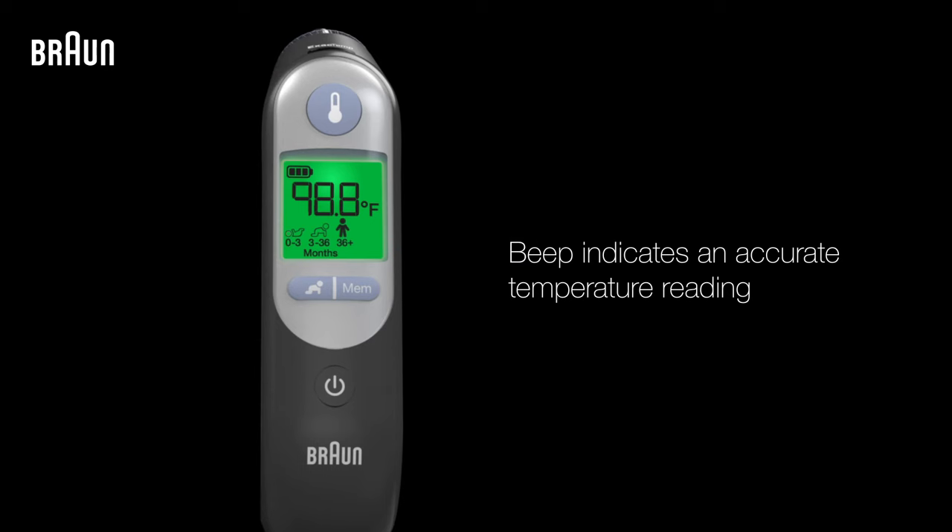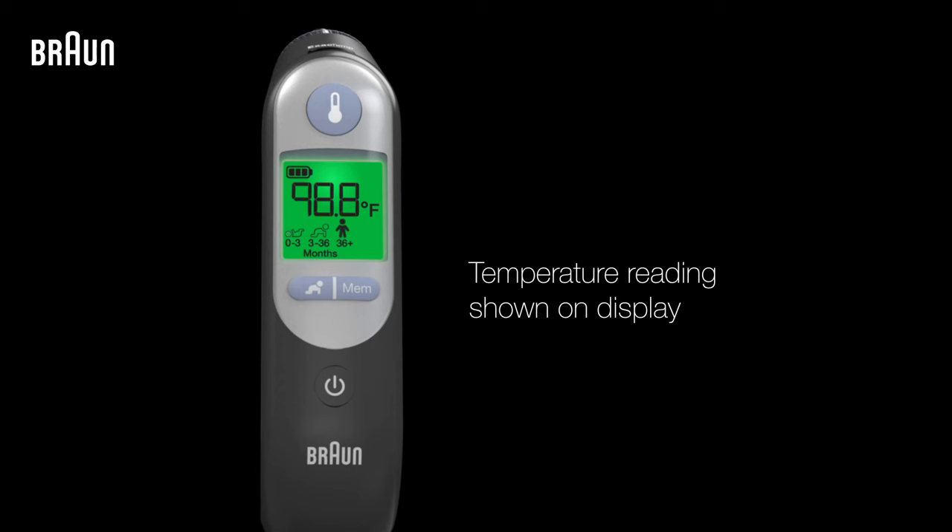Once your thermometer has finished taking a temperature reading, you'll hear a confirmation beep, and the temperature reading will be shown on the thermometer's display, along with a green, yellow, or red color from the fever guidance system, which accurately reflects your body's core temperature, providing a reliable temperature reading.